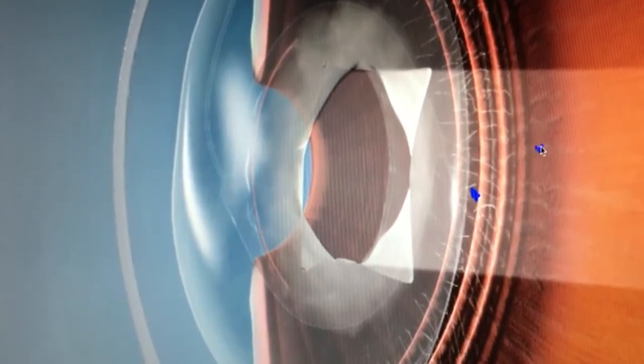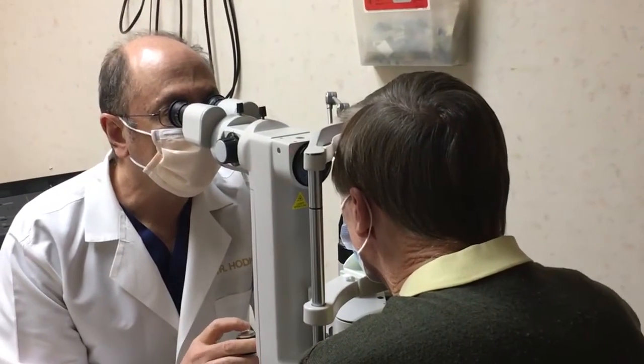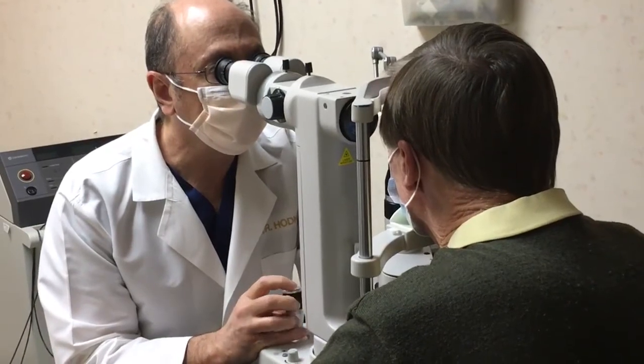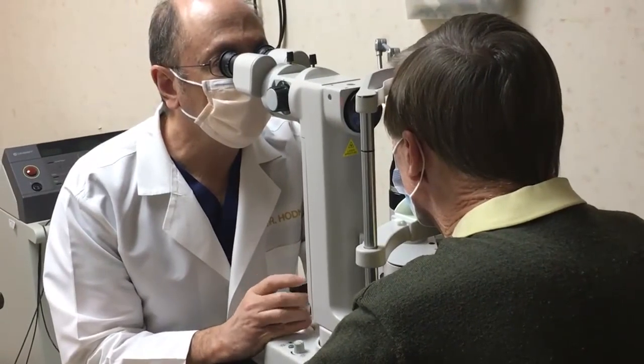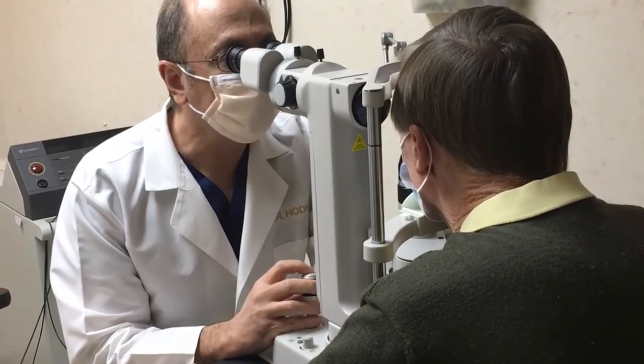The Yag laser capsulotomy procedure is a quick, painless, insurance-covered outpatient procedure which opens the cloudy capsule that lines the back of your lens implant. You don't need to go to the operating room. You just sit at a slit lamp that has a laser attached to it, similar to the one that's used to examine your eyes. We use drops to numb and dilate the eye we're going to work on, and the procedure itself takes 5 to 10 minutes.